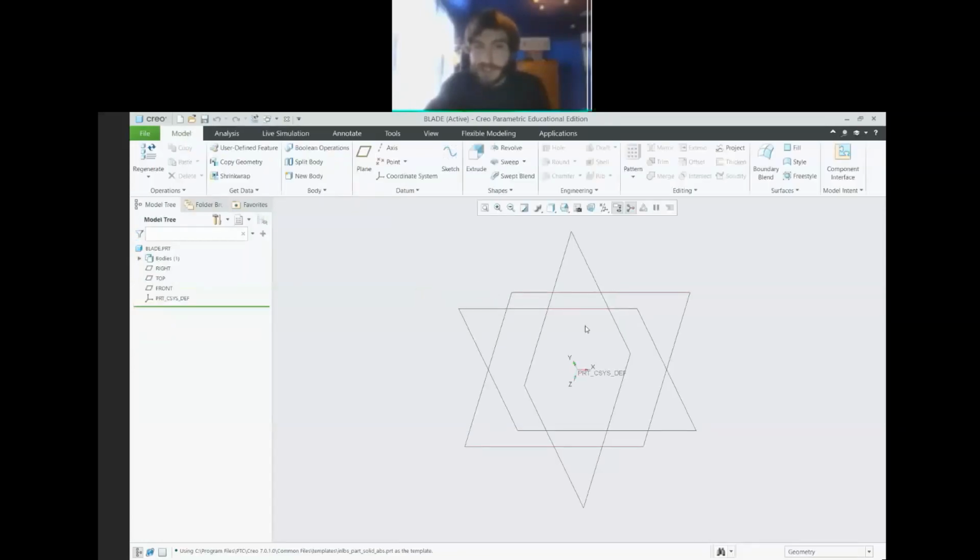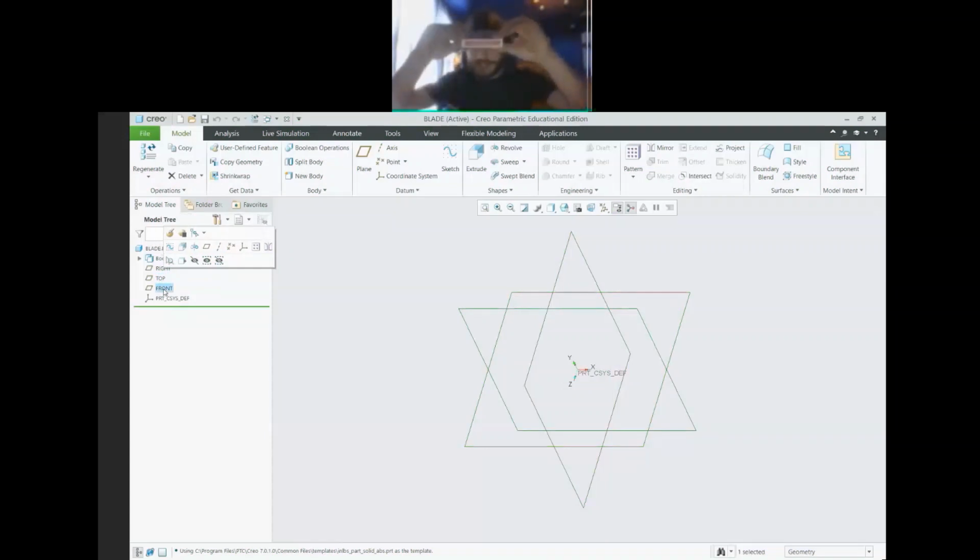Once it's done, you'll see this is the start to creating a part. You have your 3 different planes at your origin that you can use to create your sketches on: your right plane, your top plane, and your front plane. Those are the 3 different views you can look at an object: the top of an object, front of the object, side. With that, that's how we're going to go ahead and create the part.